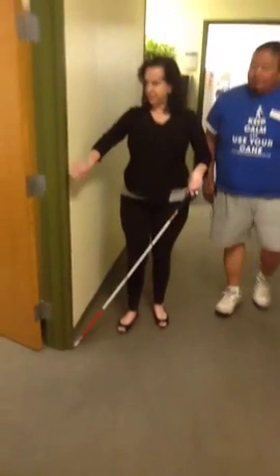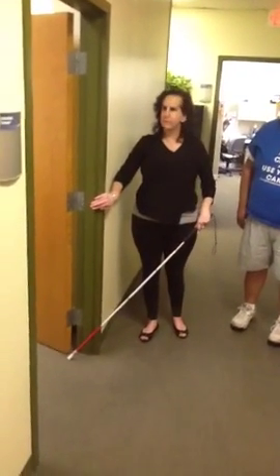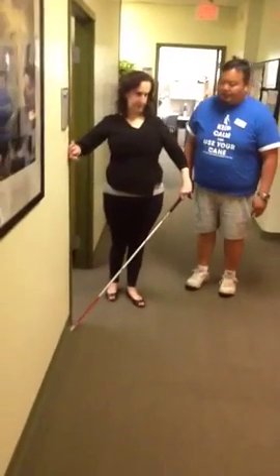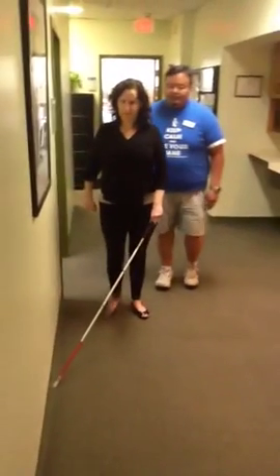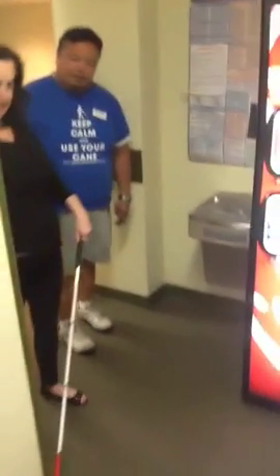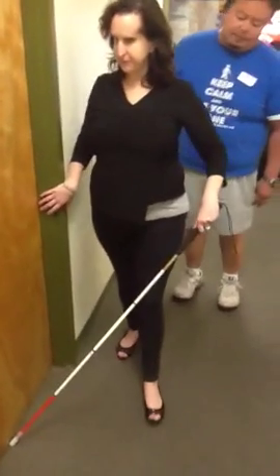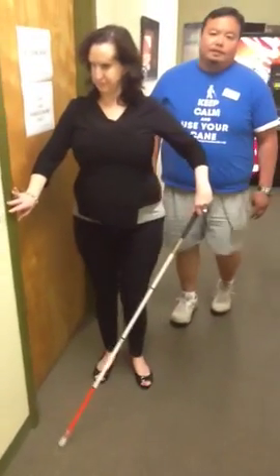Okay, what just happened? Turn. Okay, go ahead and turn with it. Right. And doorway. Okay, go ahead and find the other side to the doorway. Yeah. Keep going. Another turn. Yep, another turn. Another doorway.